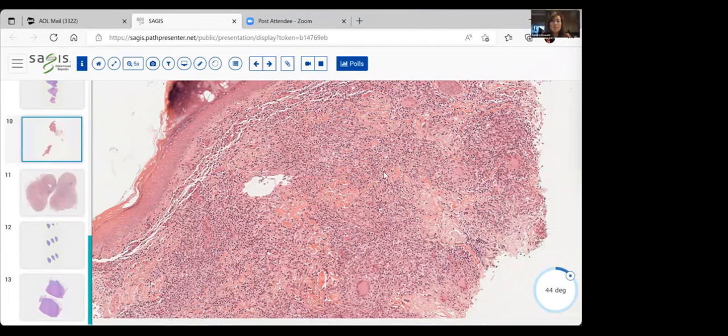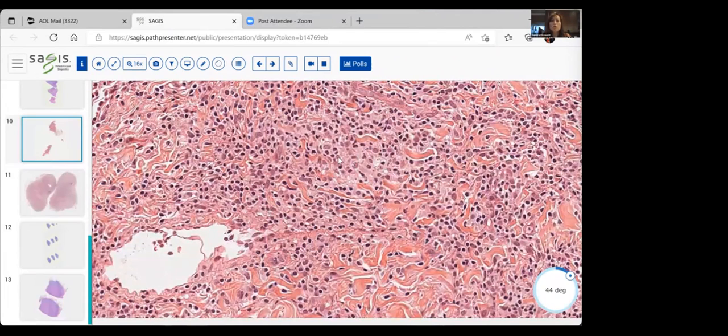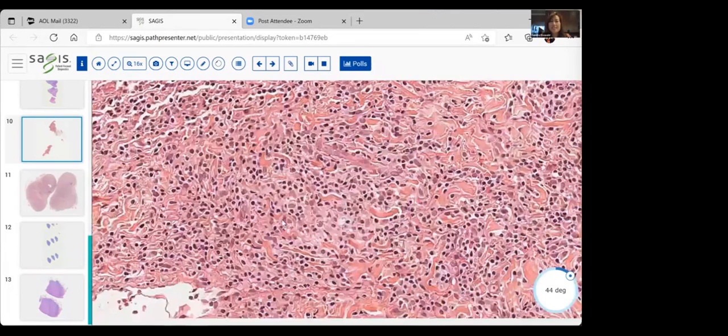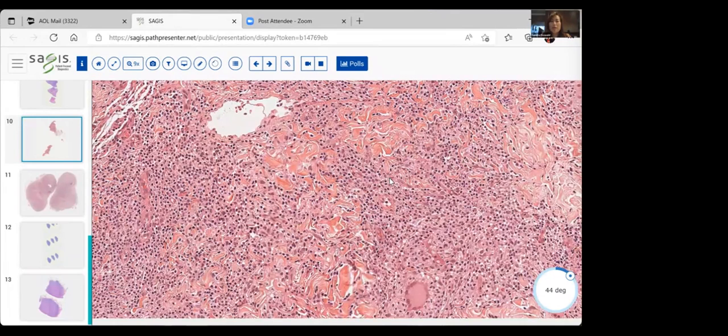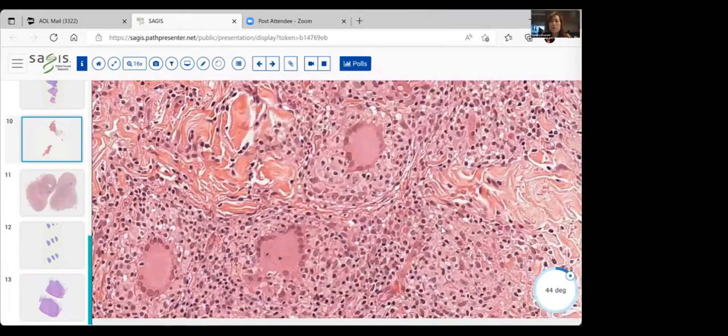When you look at what is causing most of the inflammation, you see that they are large atypical lymphocytes. They could be a little bit notched or cleaved. They're just a little bit atypical, a pretty monomorphous collection of lymphocytes. And if you don't know, of course, you could do immunostains to look at it, right? But I call it a sea of atypical lymphocytes. And then within the sea of atypical lymphocytes, let's come over this way, we saw these. Look at these cells, they're huge. Again, I feel like they're trying to have a purpose. And they're trying to come in here and react to this atypical monomorphous population of cells.